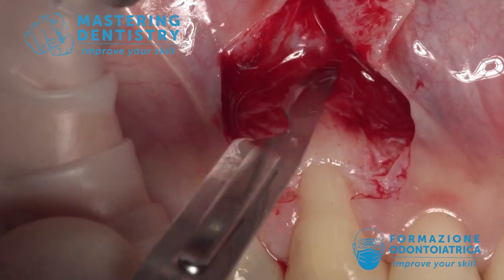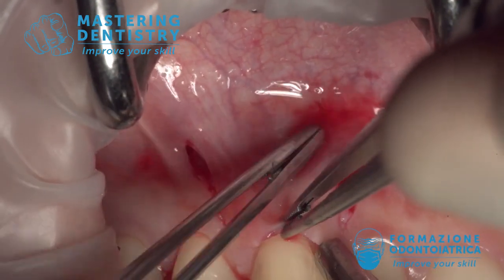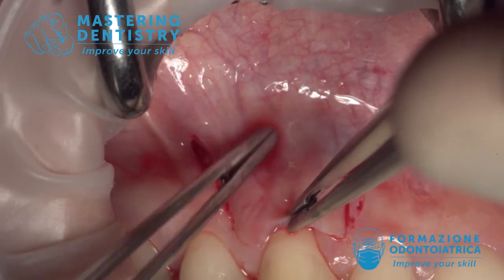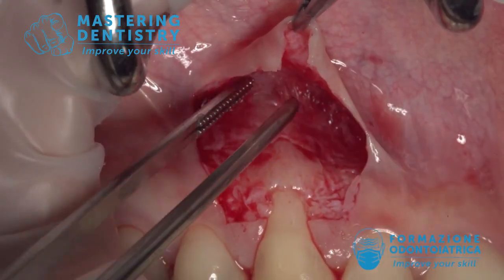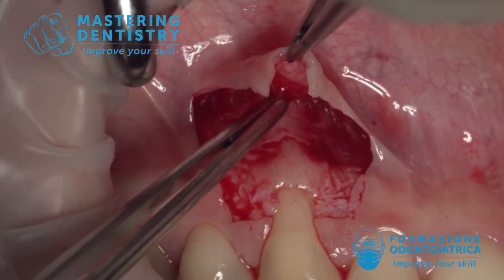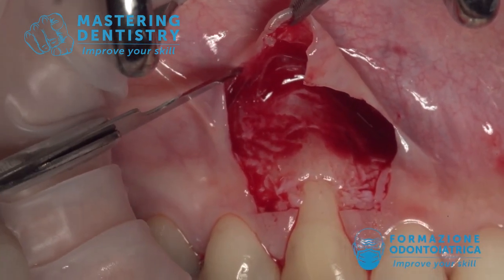Detaching all the flap muscles — now underneath the flap we have the muscles. So if we move the flap coronally, we also move the muscles coronally, and we don't want these muscles underneath our root coverage. We want there all the connective tissue and the epithelium.